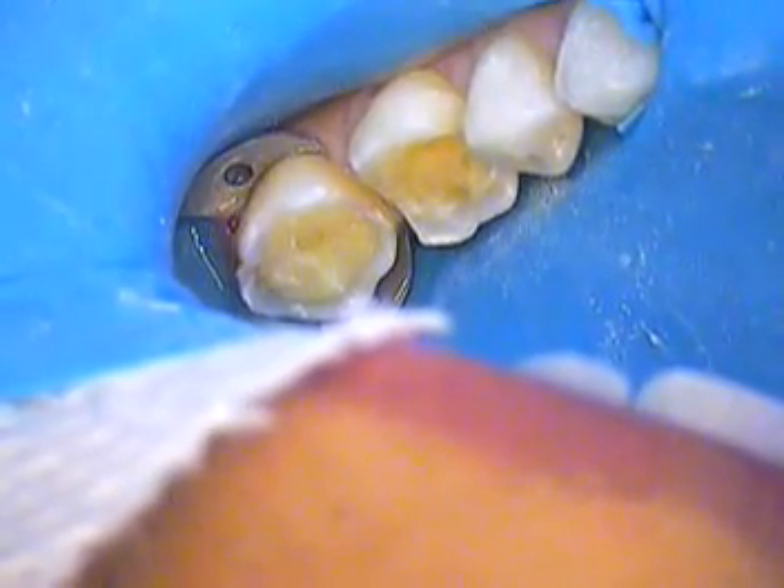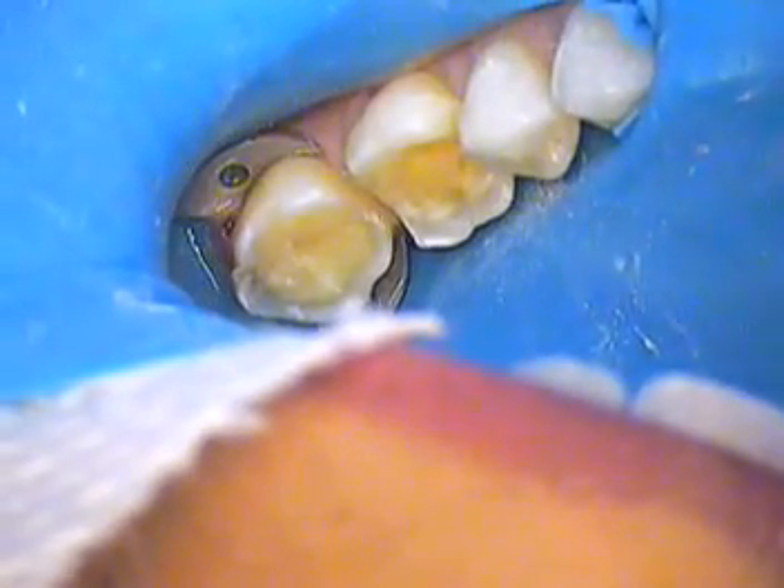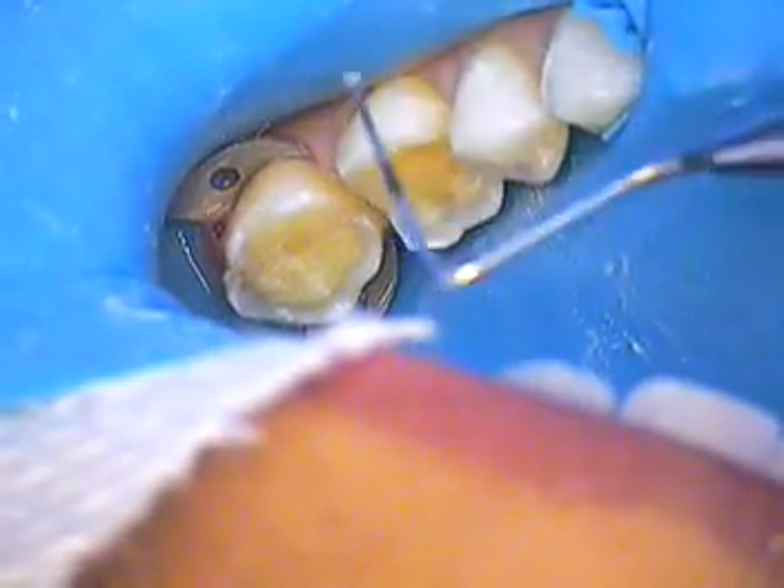Hello everyone, we're back again. I'm here with actually two dental assistants — one is helping me with today's case, the other one's in the chair. I just wanted to show you how we place this lining material.